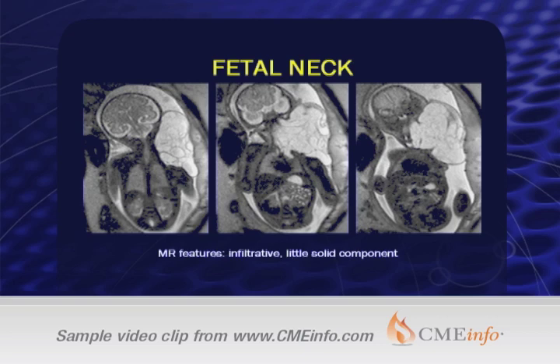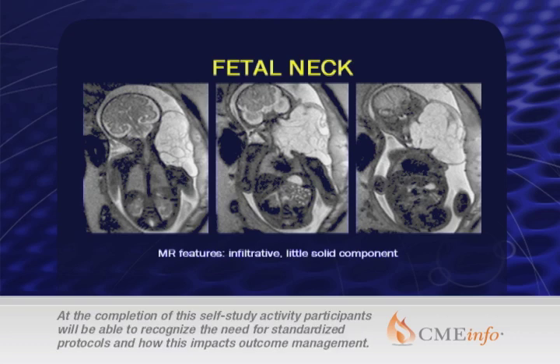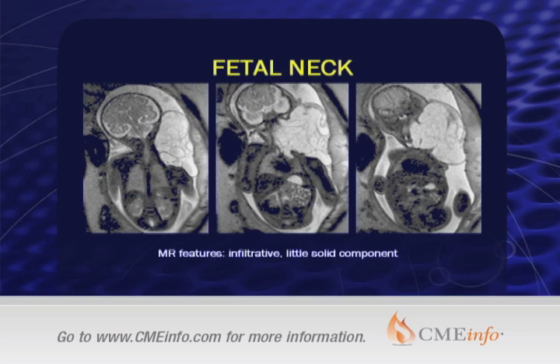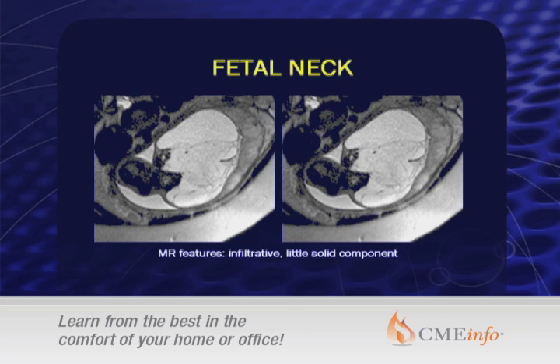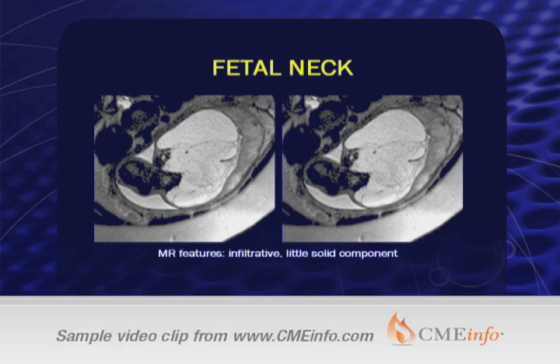On MR, in contradistinction to the germ cell tumor that's centric and pushes everything away, the key feature of a vascular malformation is absolutely no respect whatsoever for any tissue plane — it goes wherever it wants. You can see it creeping down the shoulder, up into the soft tissues of the scalp, down into the mediastinum, and throughout the neck. On axial imaging it's visible through the soft tissues of the back of the neck all the way around to the front. Here the lymphatic malformation has gotten between the cervical spine and the tracheoesophageal complex and lifted the whole thing up off the spine.